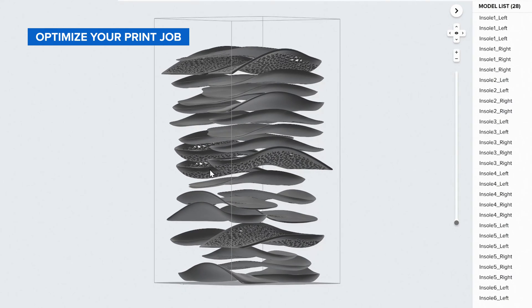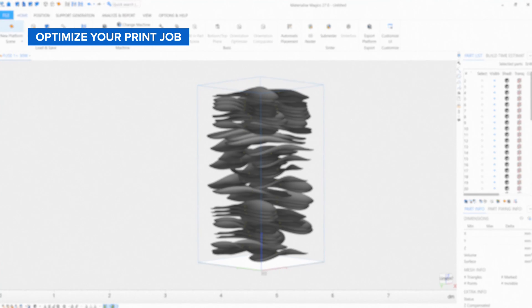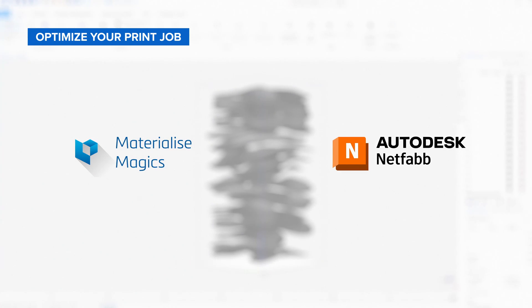For high volume production, third-party packing softwares can speed up this print preparation process. Formlabs works closely with Materialize Magics and Autodesk NetFabb to ensure you'll have a streamlined workflow for your production needs.